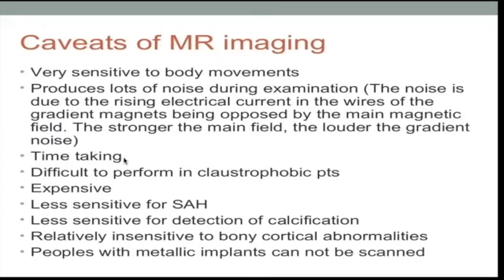Please note that the idea that it takes a lot of time means that we are incapable of using it in emergency situations. I know we're going to show you some MRI images of patients who are having a recent stroke or a hemorrhage. However, if you're working in an emergency department, do not order an MRI if you're suspecting a patient has hemorrhage and they need emergent attention, because this takes a long time and you're probably going to kill your patient if you wait that long, okay? And it's also expensive, which means that most hospitals don't have an MRI. So usually we rely more heavily on CT.